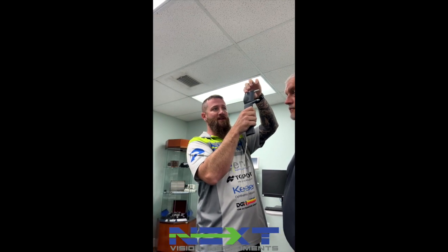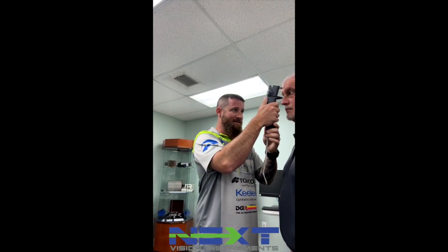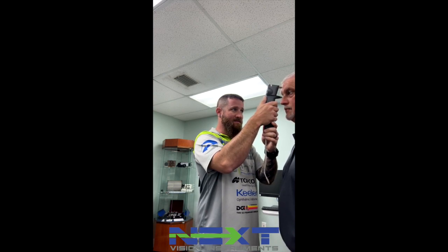If I'm getting a double beat, I'm too far away. And 13, 15.